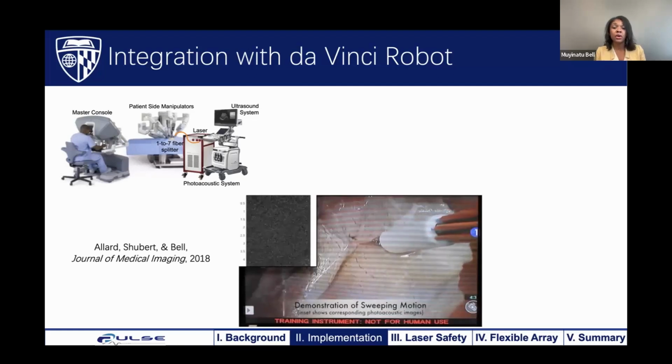And in this video, we see that there's some photoacoustic signal structure when the surgeon moves close to one region in particular, and then that structure disappears as the surgeon moves away. And so this could provide information about where to either target if that's the structure of interest, or avoid if that's the structure we don't want to hit.